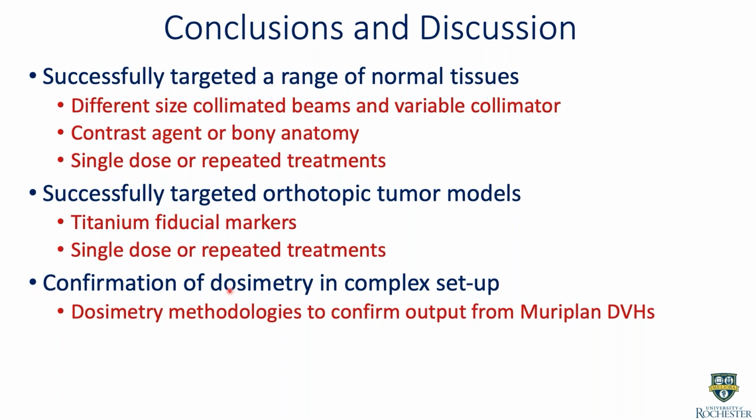And we've confirmed the dosimetry that we're getting from our system of the Muri plan using film dosimetry in complex setups using a window chamber in the cranium of a mouse. So we're looking at dosimetric methodologies to confirm the output for Muri plan.